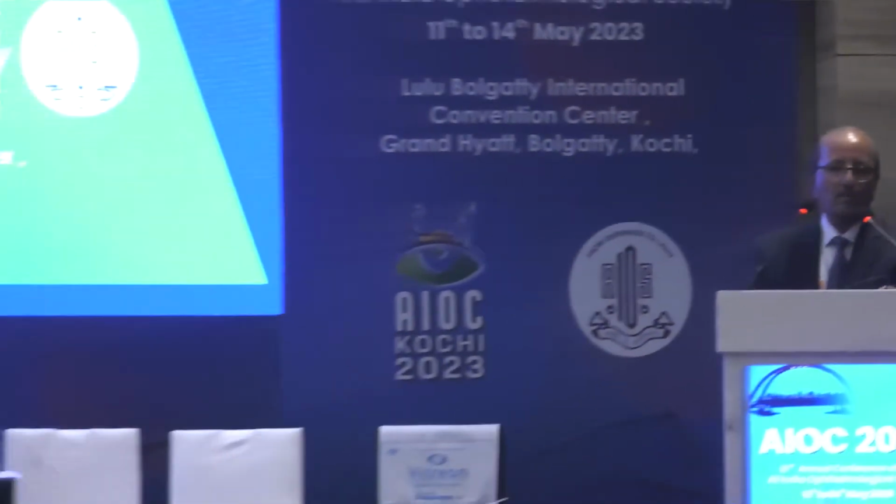JYOTI MATALIA. She'll be telling us about complex situations in pediatric cataract surgery. As he said, in adult cataract we are more interested in managing the nucleus, so how do you do the direct chop, divide and conquer, all these things. But in pediatric cataract, it's managing the anterior and the posterior capsules. That's the difference between adult and pediatric surgeries. And now Dr. JYOTI will tell us more about complex situations.